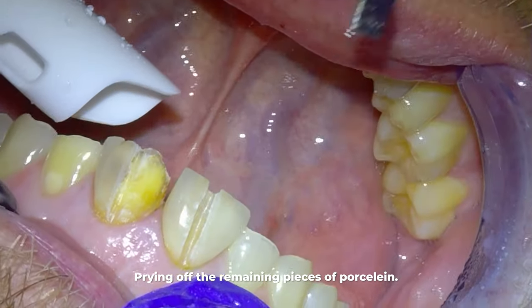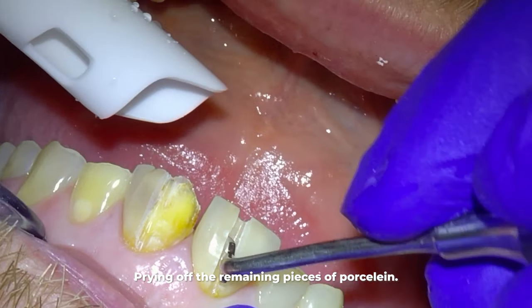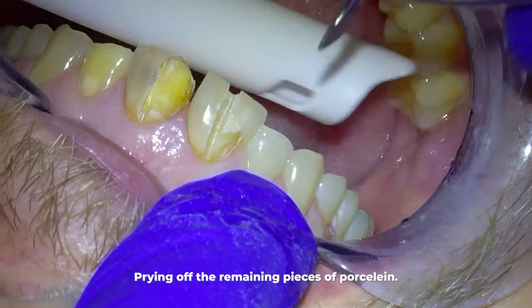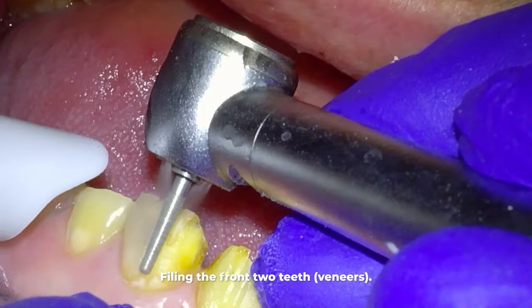After putting slots in the veneers, we pry off the remaining pieces of porcelain. You can see how the veneer pieces just shoot off, and any pieces that won't break off we have to file away with the drill.